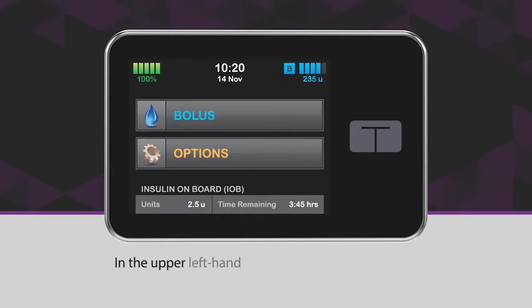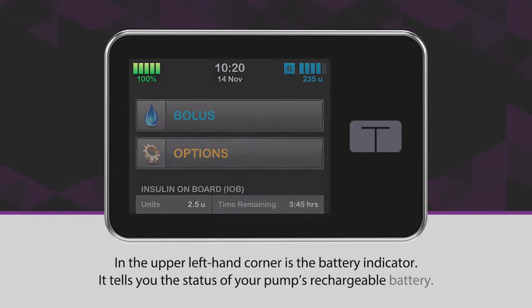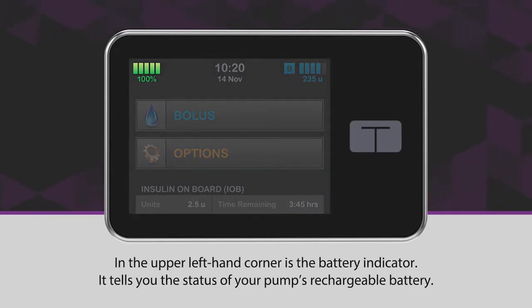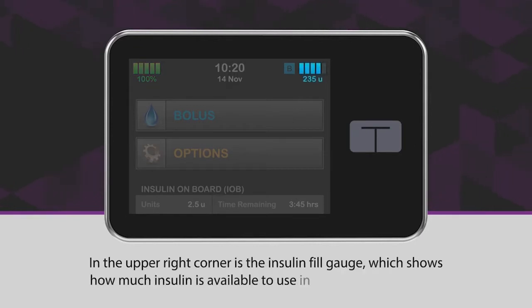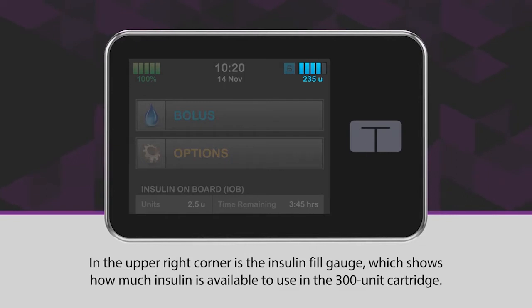In the upper left hand corner is the battery indicator. It tells you the status of your pump's rechargeable battery. In the upper right corner is the insulin fill gauge, which shows how much insulin is available to use in the 300 unit cartridge.